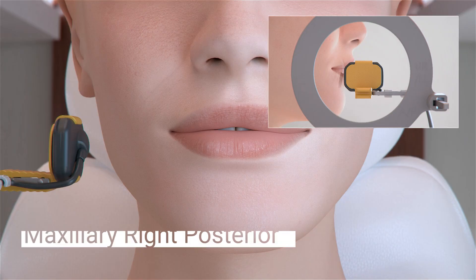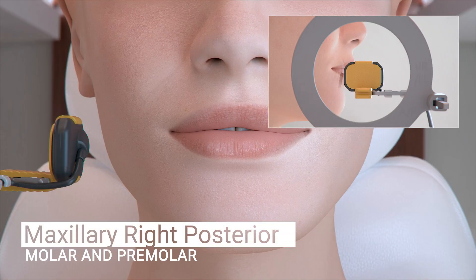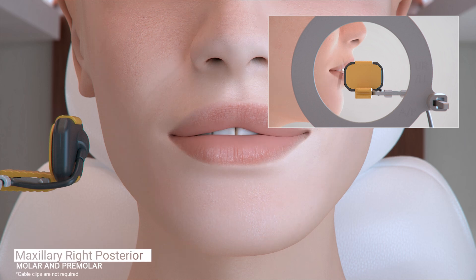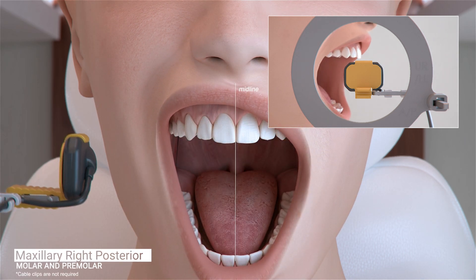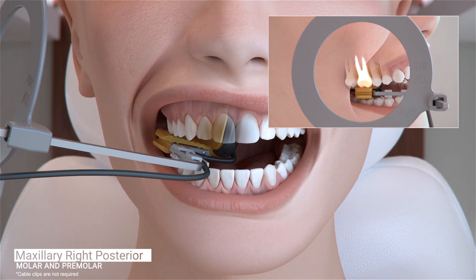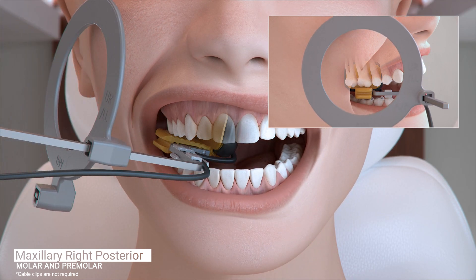The first image in our full series begins with the patient's maxillary right molar. Position the sensor in the patient's mouth toward the midline of the palate, parallel to the root of the molar, and centered on the first molar. Ask the patient to close and slide the aiming ring as close to the patient's cheek as possible.